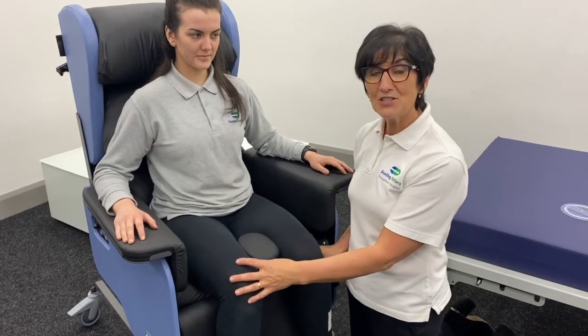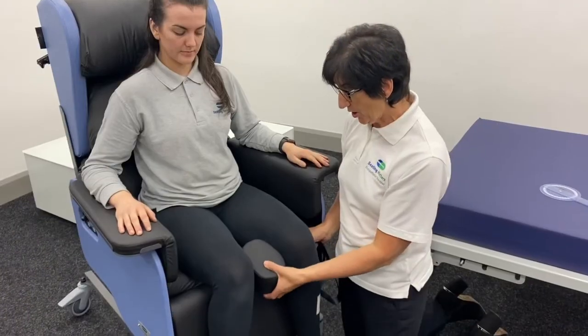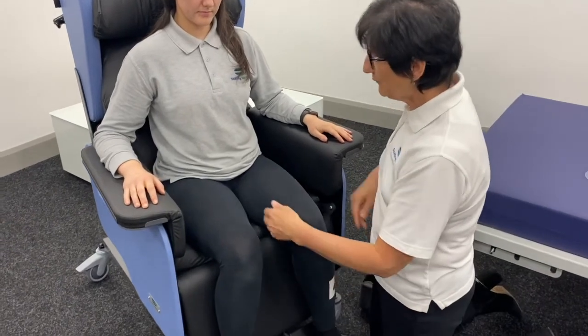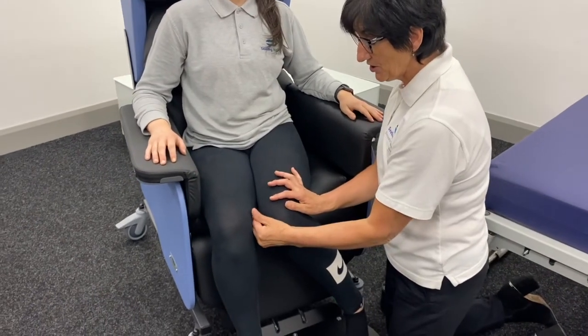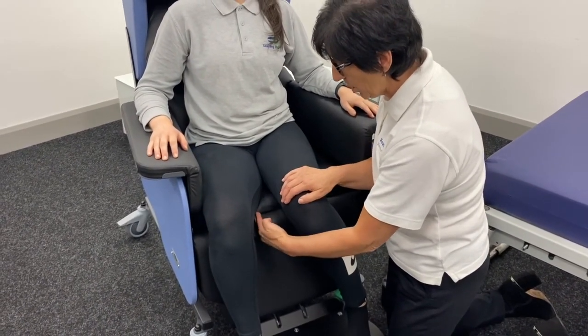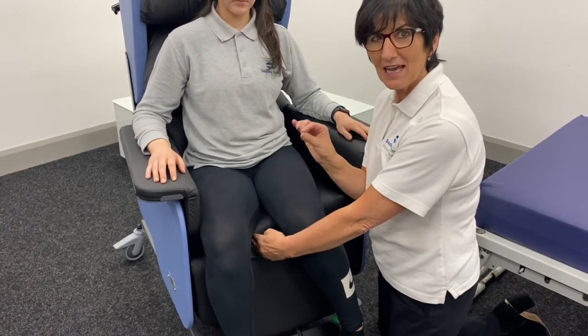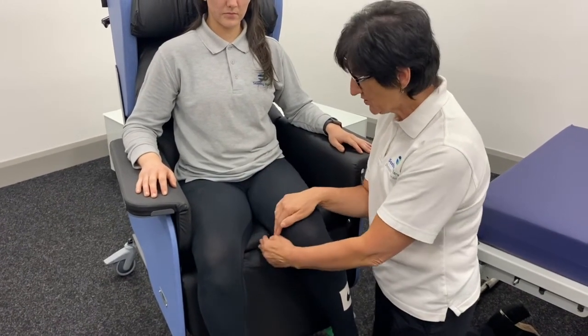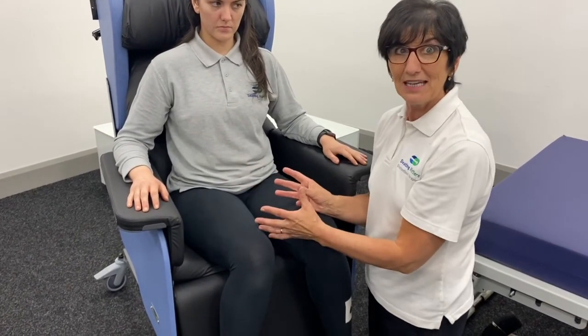If a client's knees are adducted — coming in together — you may well use a pommel. But I can't stress enough how important it is that pommels are assessed individually for each patient. Historically pommels are located centrally, but if the client is sitting in a fixed windswept deformity with adducted knees, placing the pommel centrally and trying to correct a fixed posture will cause a deviated posture. The pommel may need to be placed three-quarters of the way across the chair to accommodate the fixed position.